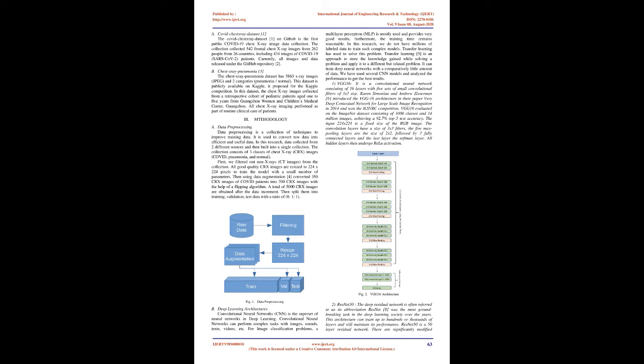To identify the disease, computer vision and AI are used to analyze chest X-ray images, picking up patterns that would not normally be recognized with the naked eye. With conventional machine learning algorithms as well as deep learning frameworks, a machine learning technique that teaches computers to learn by example, the AI model was able to predict results with great accuracy, but could be improved further with the development of new algorithms. The research carried out in the project has led to some extremely promising results, and we are looking to build on this success rapidly to help in the fight against COVID-19.